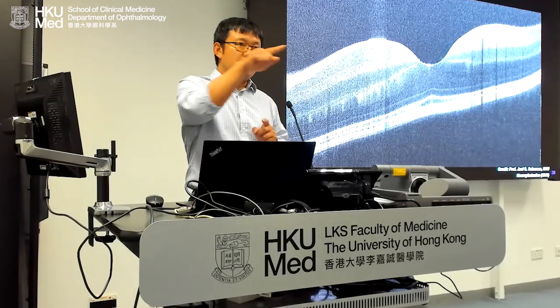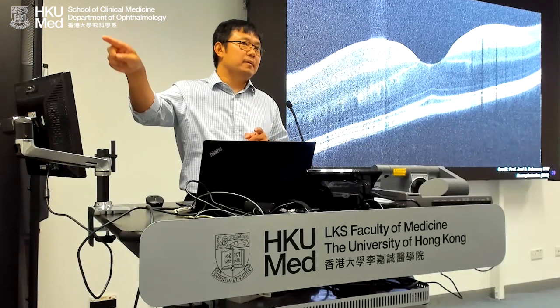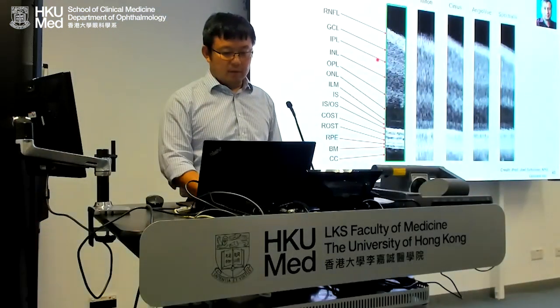Now, with his method, that's the result. So look back and forth. The speckle noise has been significantly reduced just by oscillating the scan rather than a straight line, just oscillating a little bit. And okay, now let's look at the real meat.